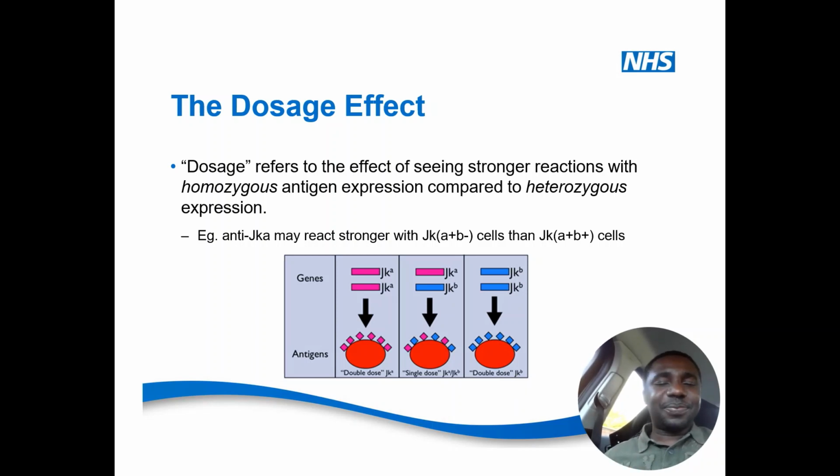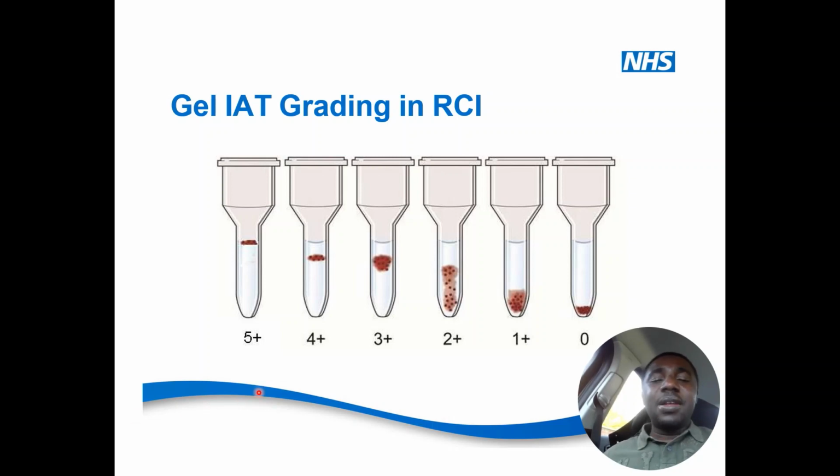So let's crack on. So now, I had already mentioned in my previous video about antibody panel that the strength of the reaction is dependent on what you can see. So you can see this is 0 because the cells all go down. But here you can see that this is +1 because it comes a little bit up, then +2. So the more up it goes, the more the plus. So here it's +5, because it is very high. Don't let this confuse you. If you go for interview, they may not even give you +5, you might get +4. But like I've said, whether it is weak, which is W, 1, 2, 3, and so on, it means that it is positive. So you need to consider that.